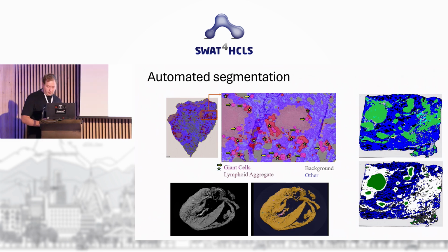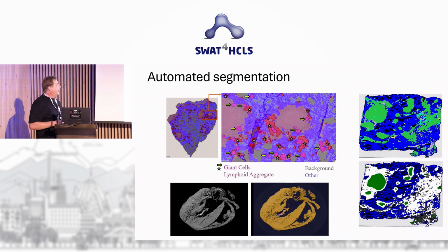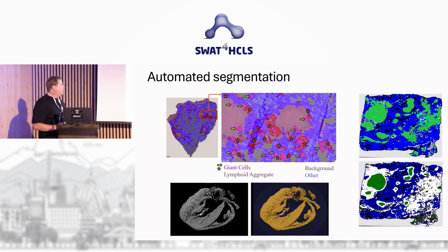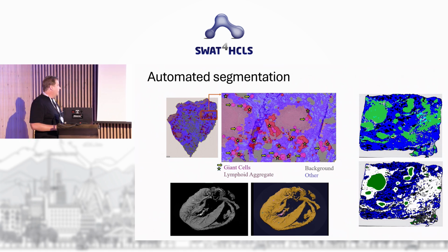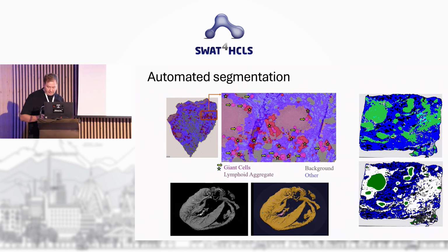We're also looking at automated segmentation. So here are some examples from the Halo software that Compango has been working with. We would like to generate lots of these kinds of ROIs of lesions and various other types of tissue to start getting statistics from that. And in this case, this is some automated segmentation I've been trying out on 3D in the micro-CT. And ultimately, we would like to pull these ROIs and link everything together with the rest of the repository.